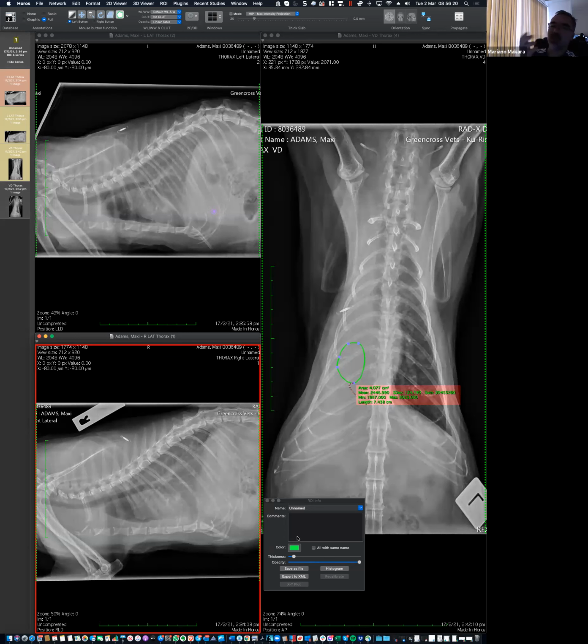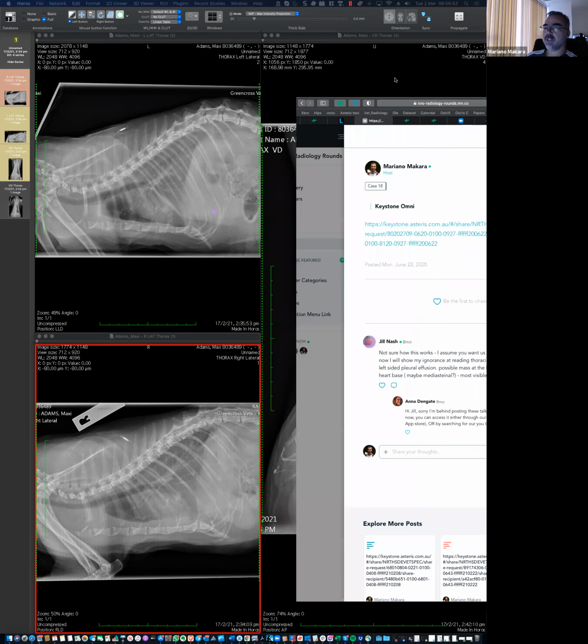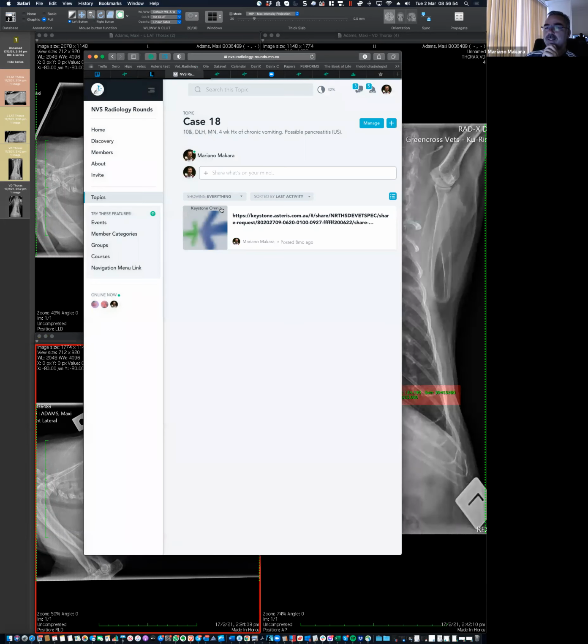Yeah, it took me a while to find the other case yesterday. I spent like an hour trying to find that CT, and then I realized that we already talked about that one. So for anyone interested in this particular pathophysiology of obstructing the airway and what is the result, we can go back to that discussion where I think we went into more detail about the CT. What I could try to do, if I have the ability, is to upload the CT to that case, so you can review the radiographs and the CT together.